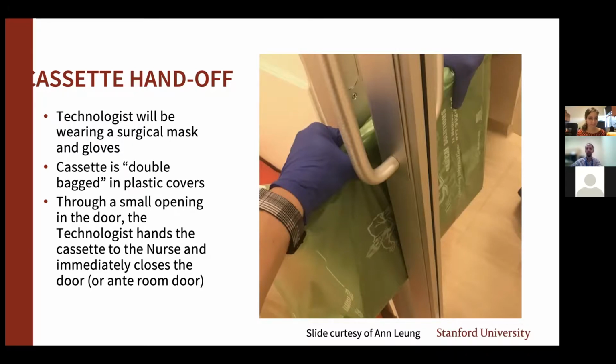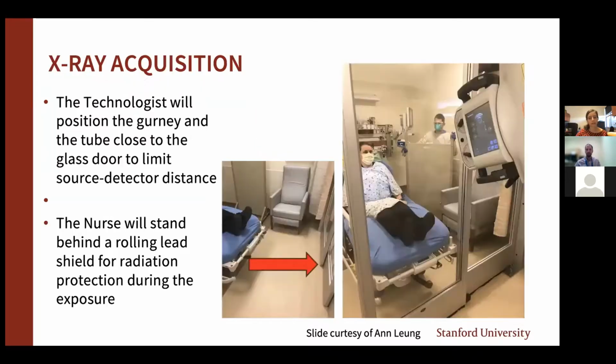Right. This was going to be a question I had. How many people does this technique now remove from being in the room with the patient, and in total? Does it actually reduce the number of personnel required? It doesn't reduce personnel, it just reduces PPE. For example, the masking and the gowning was a big issue, at least for us here. Our nursing staff stuck with that, and our technologists didn't need that, working on the outside. But I think pretty much anyone can get N95s now. Yes, it was a bit sparse in the first few months.